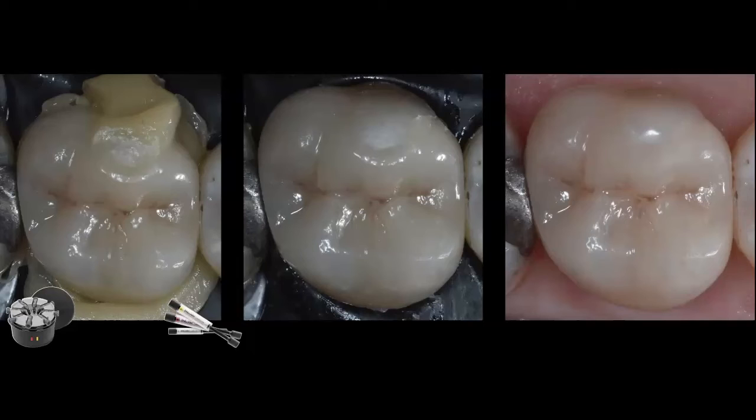Not to mention that it is dual cure, so the activation of polymerization just happens by mixing the base and the catalyst. So here you're going to have a lot more time, but you also have to be worried that you're going to have to cure through that ceramic. You're going to have to cure longer. So what I normally do is that once I remove all the excess, I go ahead and I cure 30 to 60 seconds per surface.